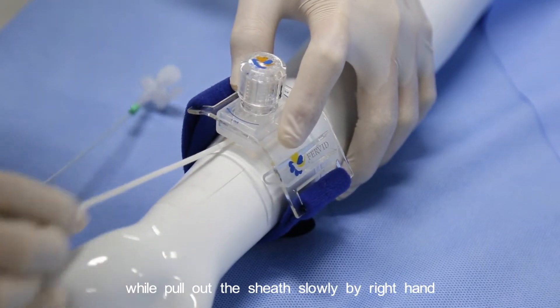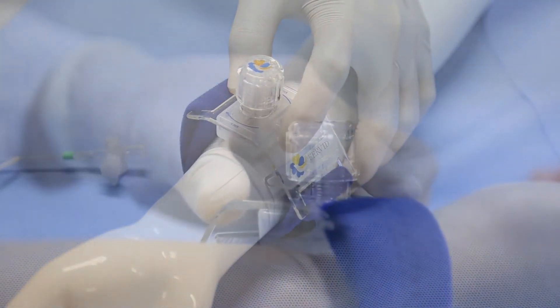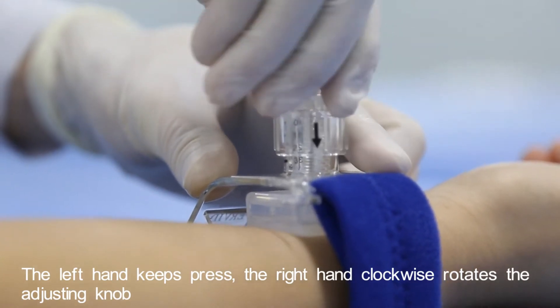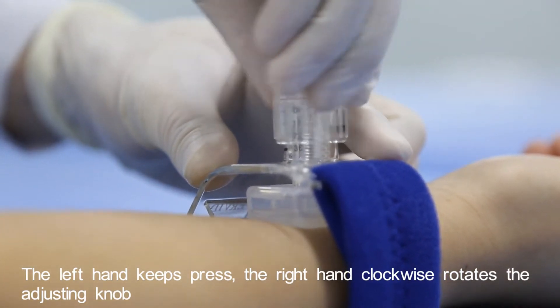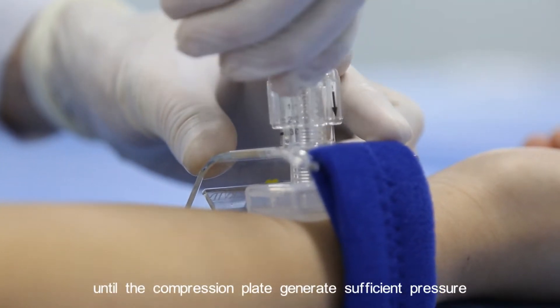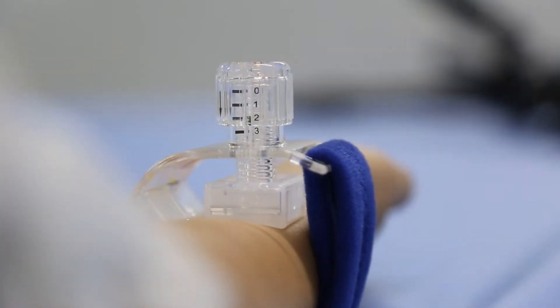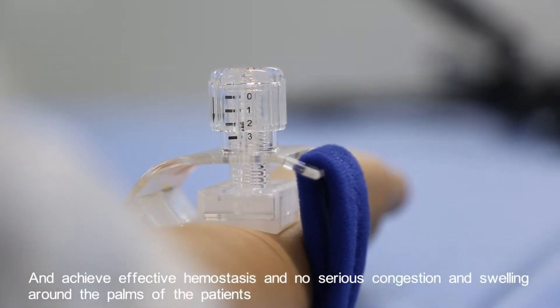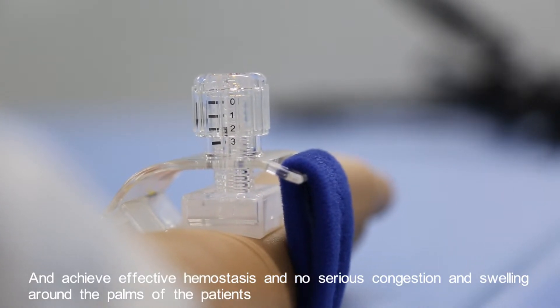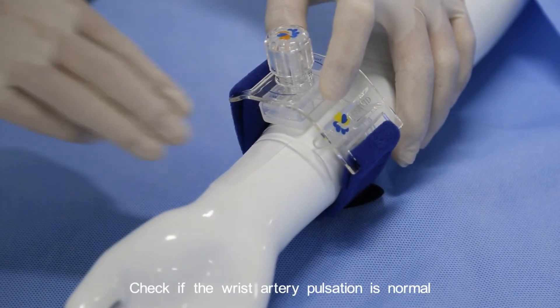The left hand keeps pressing while the right hand clockwise rotates the adjusting knob until the compression plate generates sufficient pressure, achieving effective hemostasis with no serious congestion or swelling around the palms of the patient.